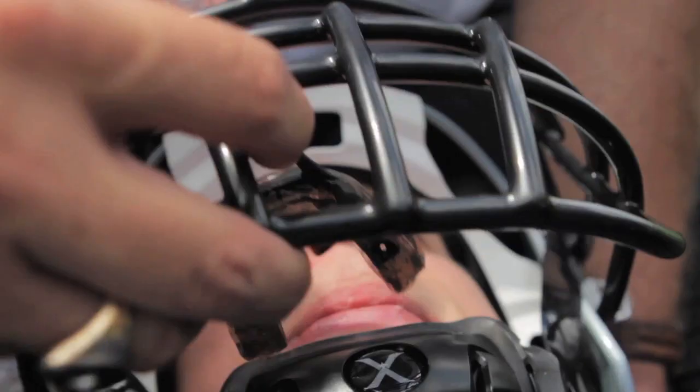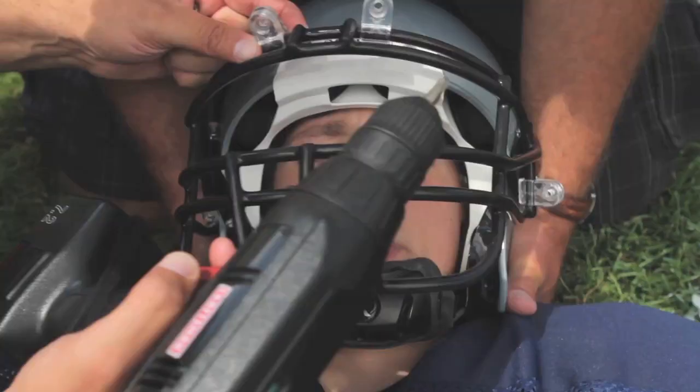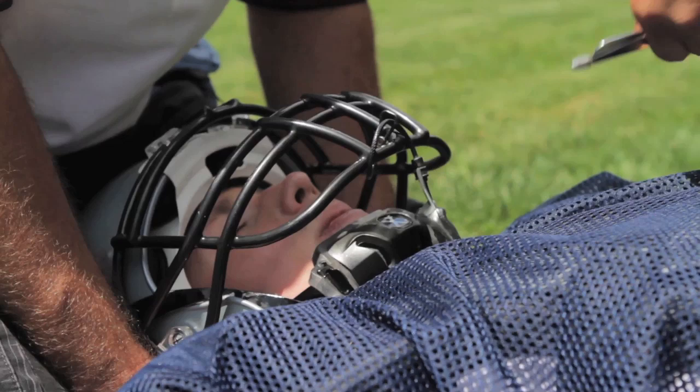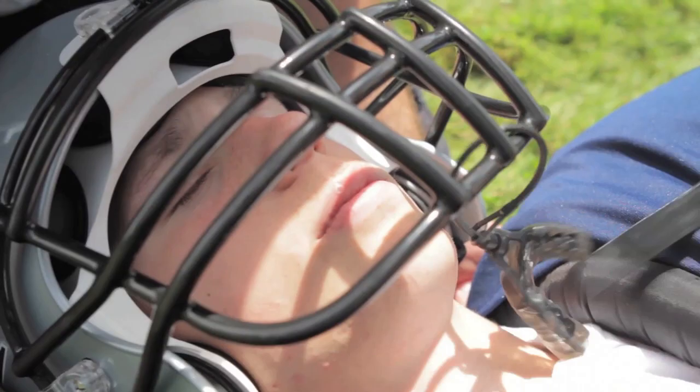Stay as still as you can and listen to us and we'll get you home safe. We begin by removing the mouth guard and cutting the chin straps, which will not result in further movement of the head, and then removing the chin cup.